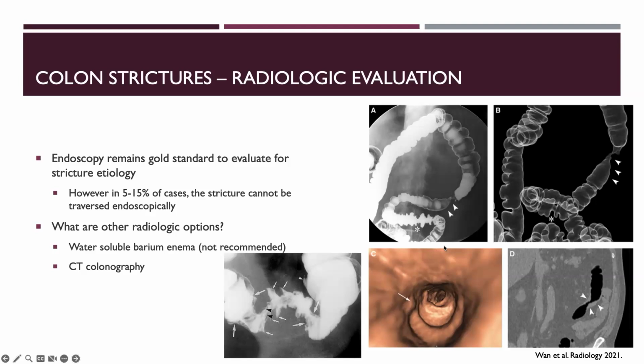The next is CT colonography. You can kind of see that version in C and B. And so CT colonography requires bowel preparation, right? So you can't do it without a bowel prep of either some Dulcolax or some Pico-Salax or a little bit of MiraLAX. But again, a lot of patients are so obstructed that they can't undergo a prep. And so the utility of the CT colonography significantly goes down if you're unable to prep for the scan.